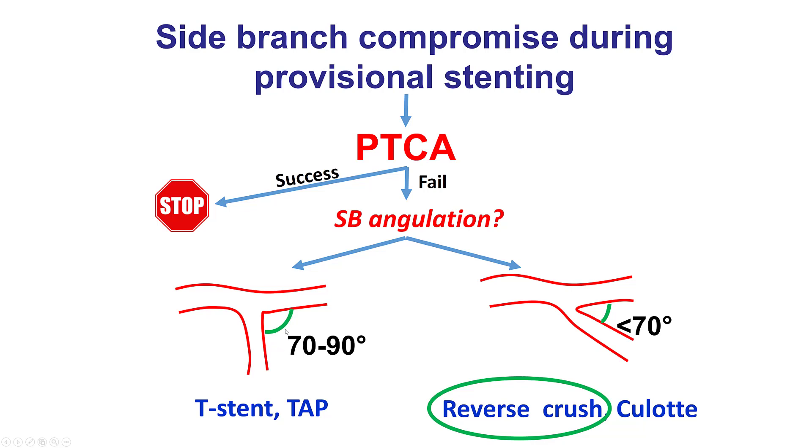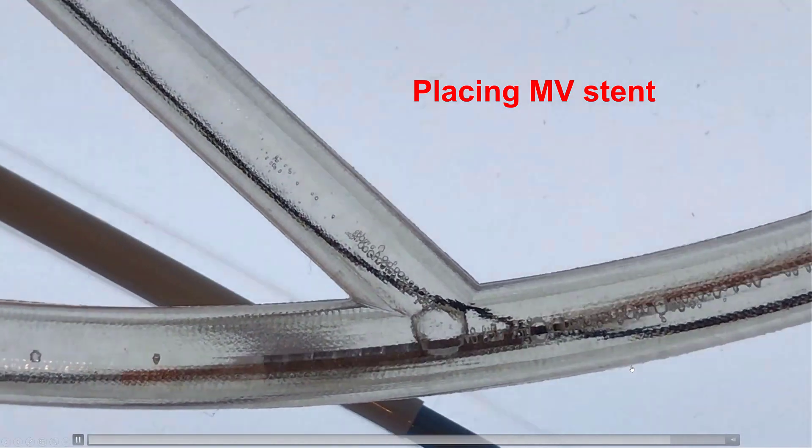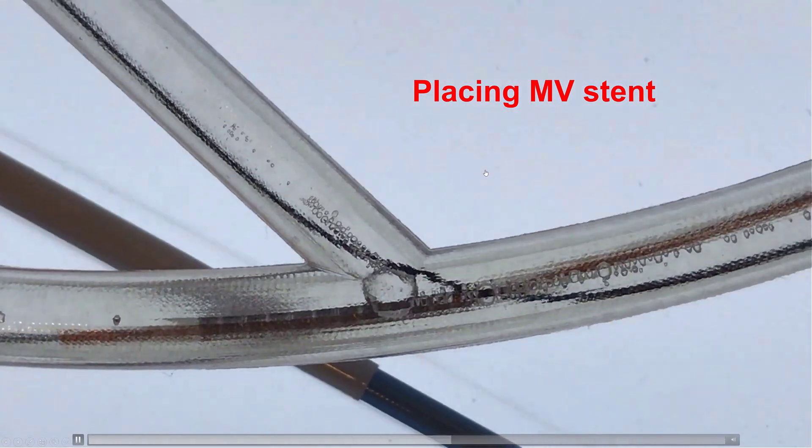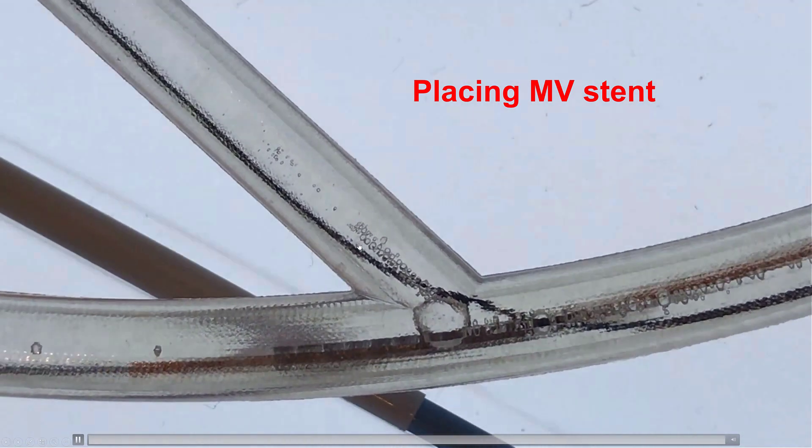If the angulation is about 90 degrees, then T-stent or T-and-protrusion is used, very similar to the general algorithm. Whereas if it is less than 70 degrees, then one can use either the reverse crush technique or the Culotte technique, which is described in a separate video. And this is an example of the scenario when the reverse crush is needed.